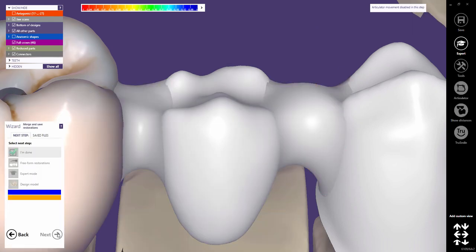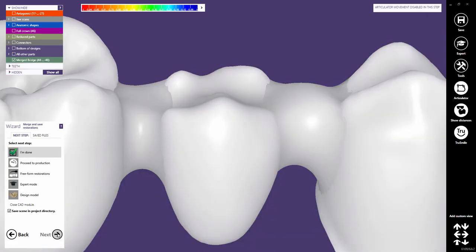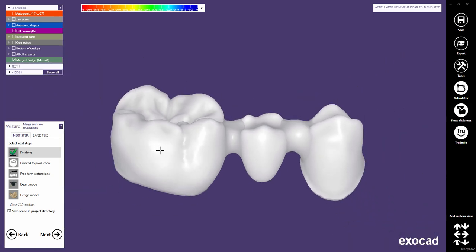Click OK to proceed to the next step. The restoration will be merged and saved now. In this last wizard step, you can decide what to do next. 'I'm done' means that the scene will be closed and saved. 'Proceed to production' launches the integrated CAM module. 'Free-form restorations' allows you to free-form the entire merged restoration. 'Expert mode' allows you to further edit your restoration — for example, if you want to change the margin line or the insertion axis, you can still do this now without losing your existing design. For details about the expert mode, please see our separate video tutorial. 'Design model' will start the model creator module.